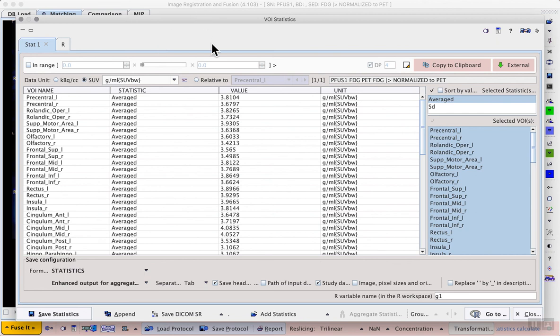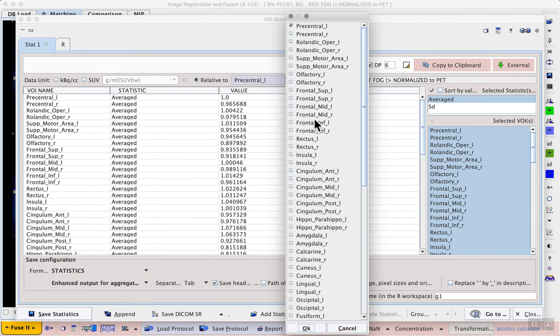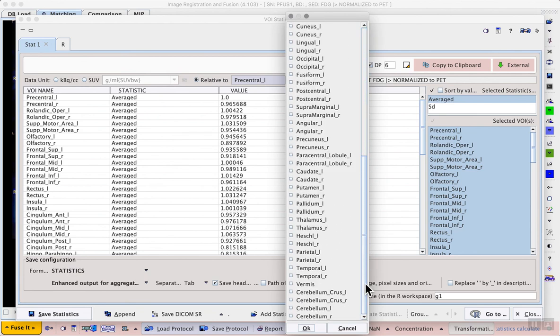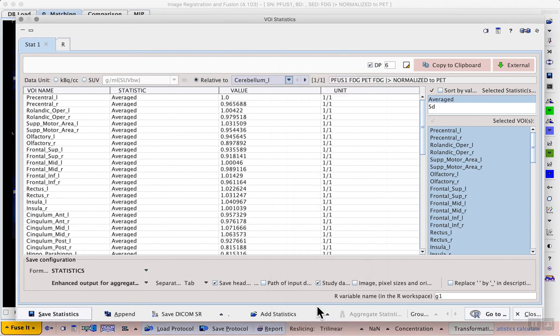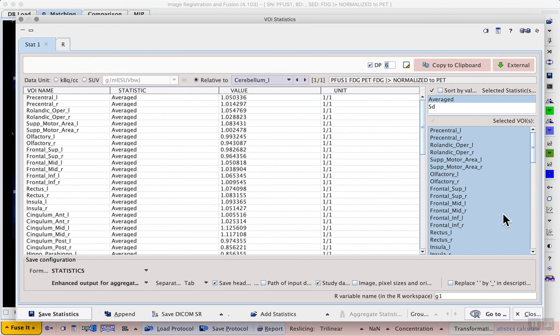If we're interested in something like SUVR we can also make everything relative to a given reference region. In this case scrolling through the list of VOIs we could select at the moment one part of the cerebellum and we already have an SUVR range in the statistics which again can be saved or could be copied to clipboard for transfer into something like Microsoft Excel.